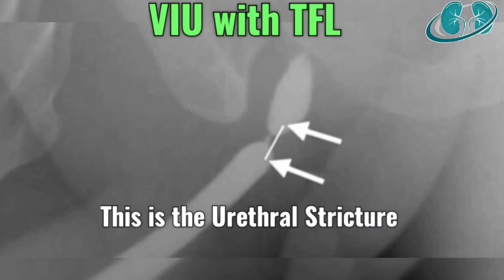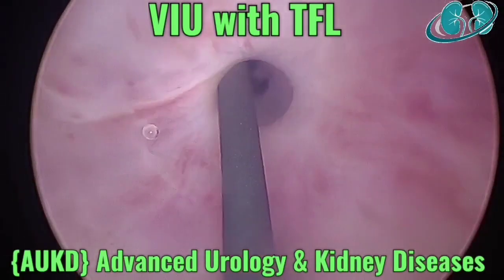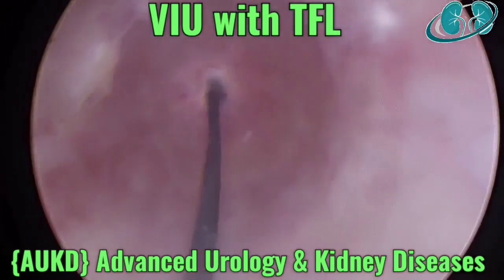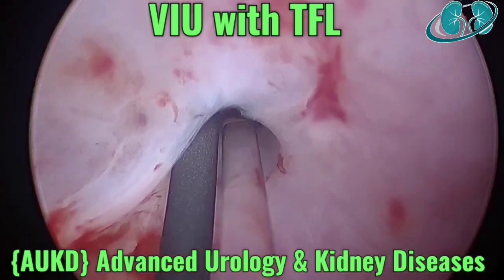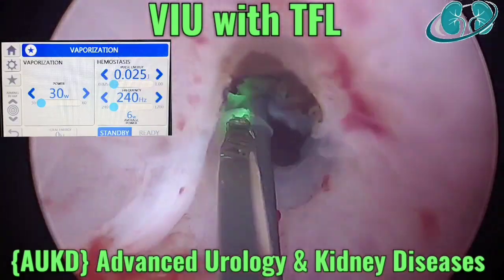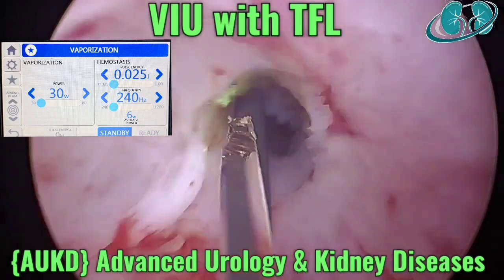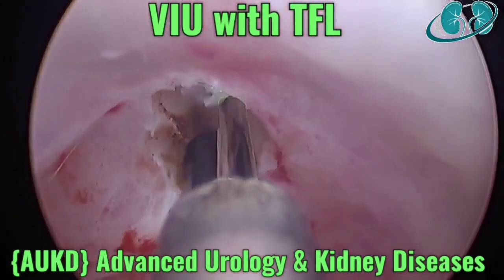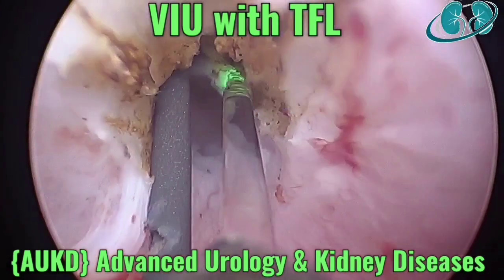Let's go ahead with the video. Retrograde urethrogram showing approximately 1 cm distal bulbar urethra. As you can see after cystoscopy, the guide wire is in place, and this is the Thulium fiber laser at 30 watts with a 600 micron fiber.